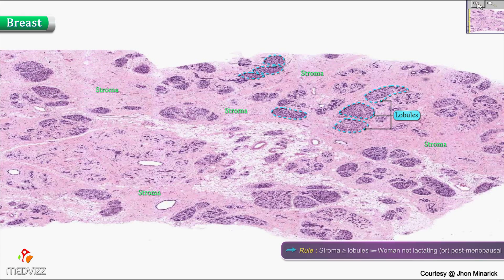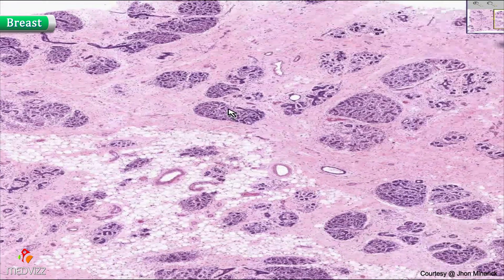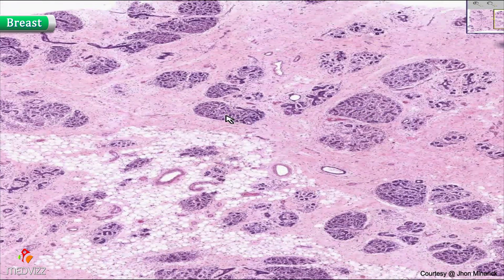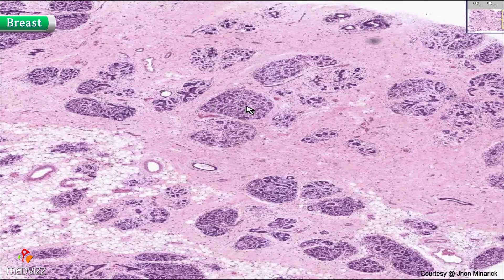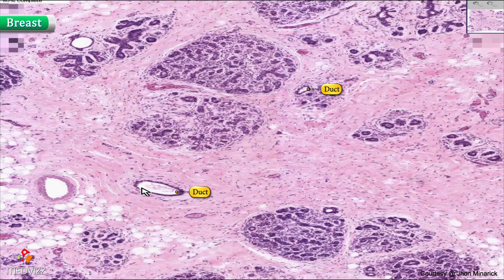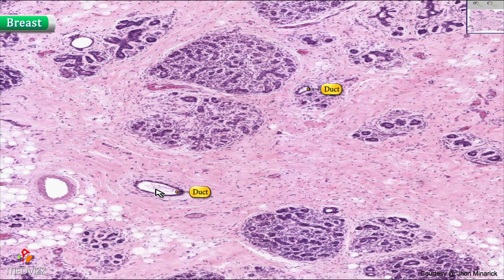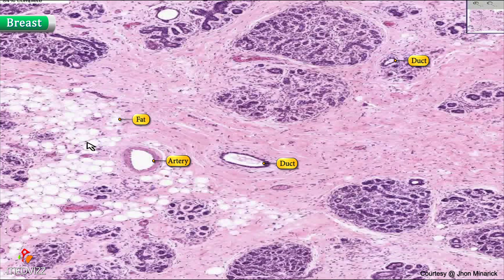This is somebody who is not producing milk — it could be somebody postmenopausal. Also notice that when you look within the lobules, you do not see any secretions either. These are ducts of the breast. Here's a duct within the lobule, here's a duct between lobules, here's an artery, and here's some fat. There's always a lot of fat in the breast.